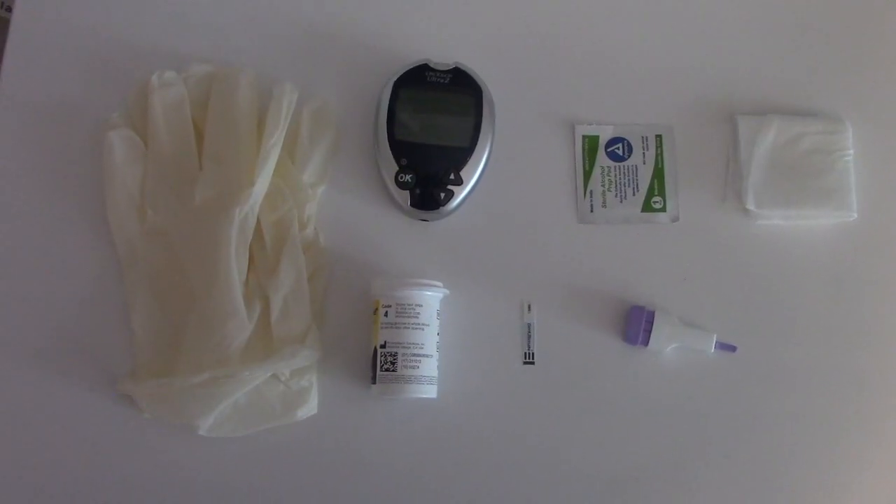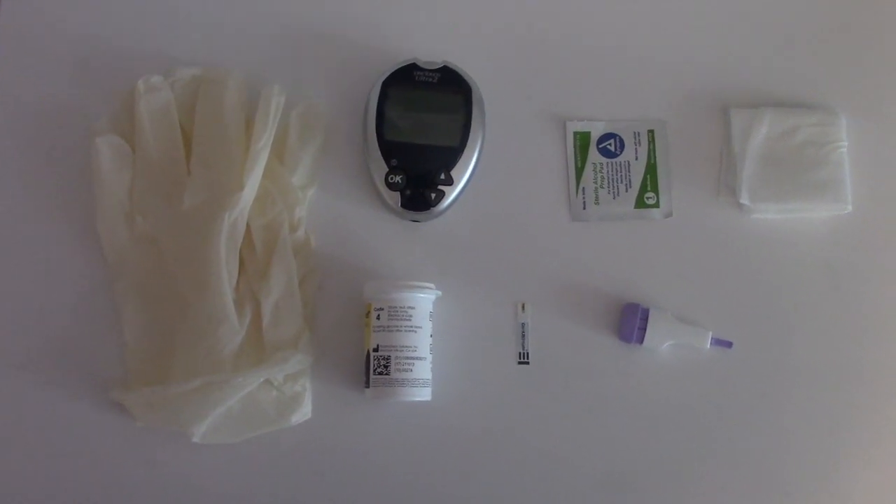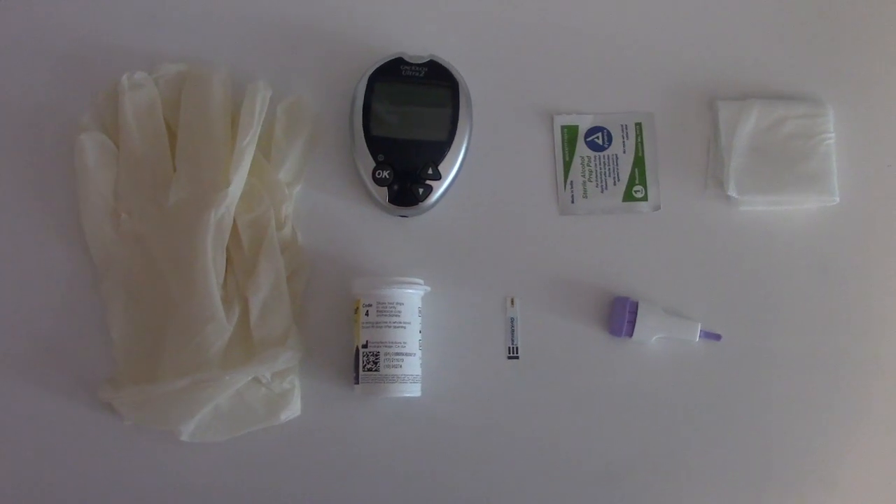Now that we've reviewed our normal ranges and gathered all of our supplies, let's jump into our patient scenario. Before we get into the room, we're going to wash our hands, do hand hygiene, provide patient privacy, and verify our patient with their name and date of birth. Could you please tell me your name and date of birth? My name is Bob Dallas. I was born July 27, 1977. That's what it says on my chart, so we have the right patient.